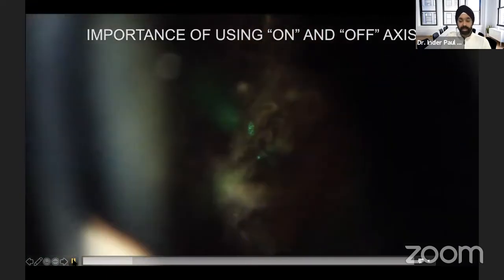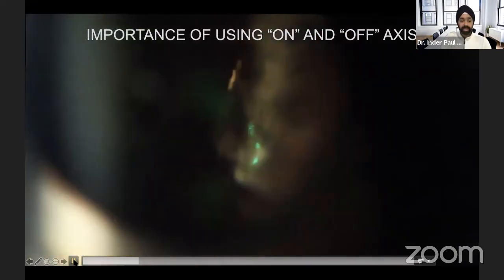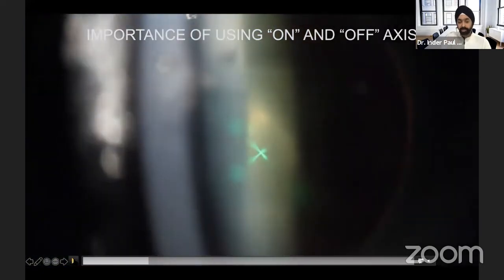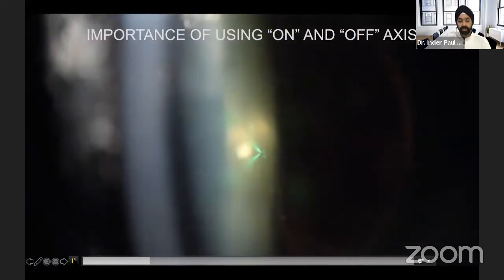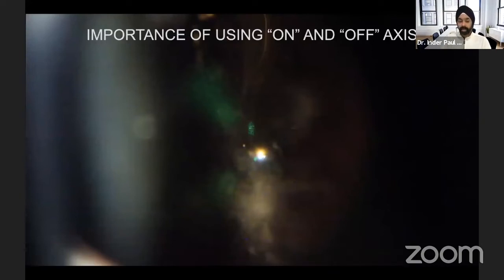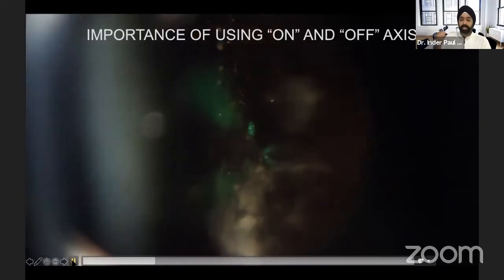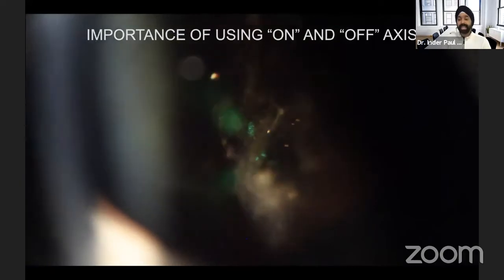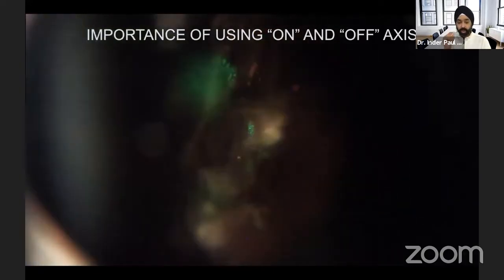So as I start firing here, you're going to see all of a sudden I'm firing. Now I'm going to stop and say, where's the posterior capsule? Okay, so there's a posterior capsule. Now I can move posteriorly and see there is the floater. So the space between the lens and where I fired is like the anterior chamber depth. That's how we can understand how far we are from the posterior capsule. So being able to titrate the illumination, going oblique like I did now, or coaxial if it's further back, allows us to know where we are in the vitreous. Again, spatial awareness. And this is what makes this laser so unique.